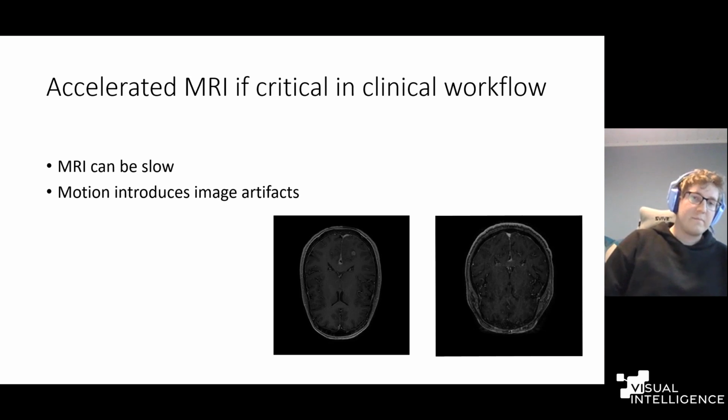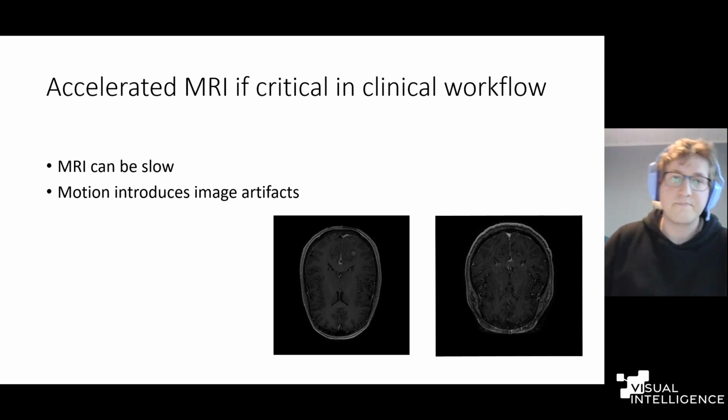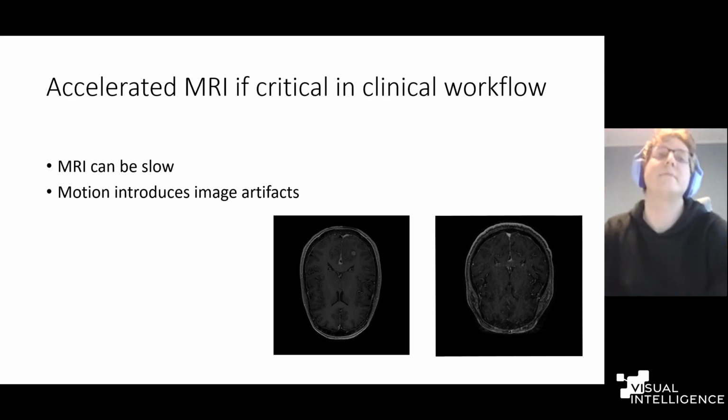And you can also have cases where it's difficult to make the patient go through a full scan. For example, they can be in pain or similar things like that. So the acceleration of MRI is quite important.